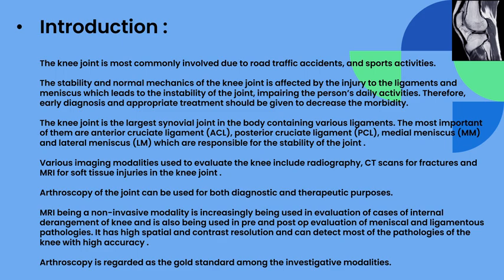MRI, being a non-invasive modality, is increasingly being used in evaluation of cases of internal derangement of the knee and is also being used in pre and post-op evaluation of meniscal and ligamentous pathologies. It has high spatial and contrast resolution and can detect most of the pathologies of the knee with high accuracy. Arthroscopy is regarded as the gold standard among the investigative modalities.